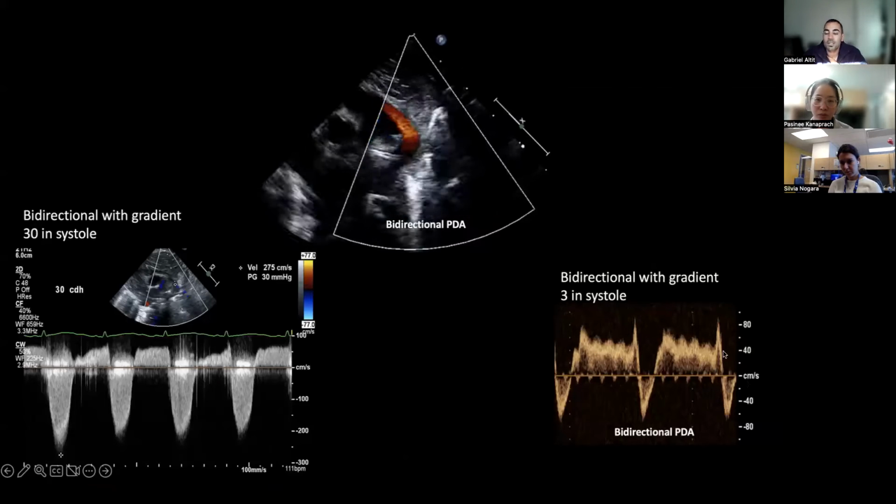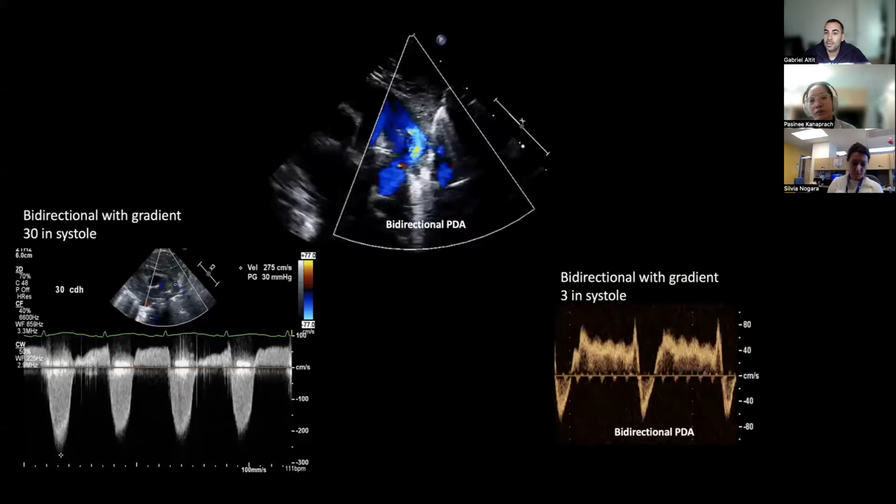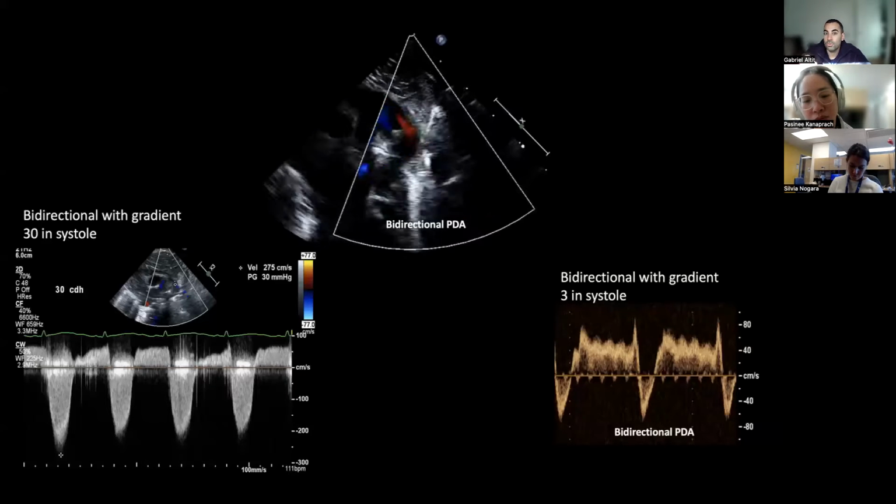So this PDA, just seeing it here, could be a preemie baby, like the first day of life. We often see that, the first day of life in a preemie who still has a bit of a higher PVR, the PVR have not dropped yet, and it's a huge duct. So in many of the trials, this patient would have been recruited to give one of the treatment drugs, right?